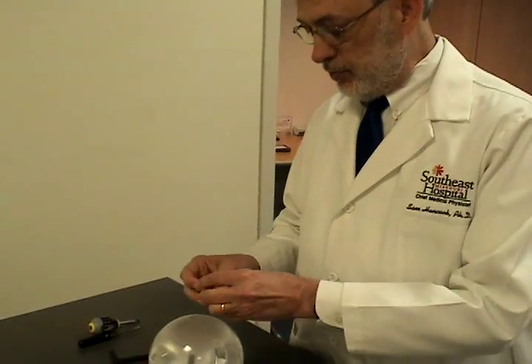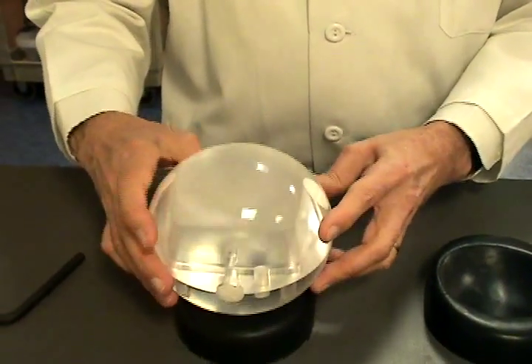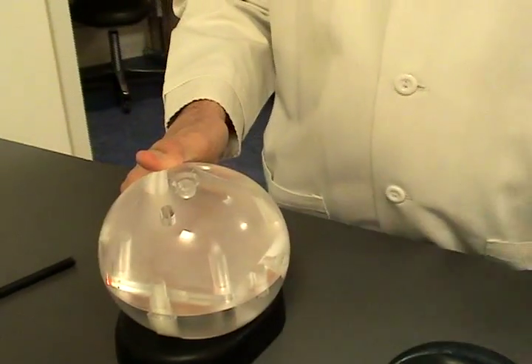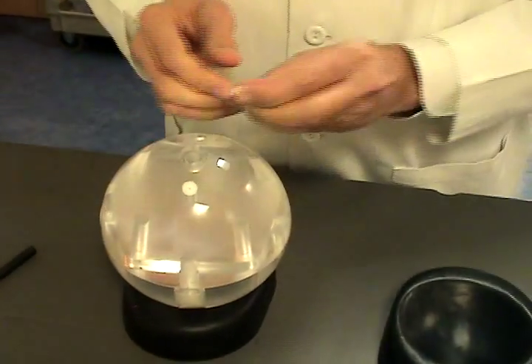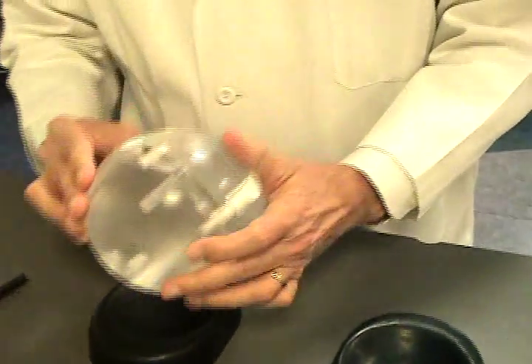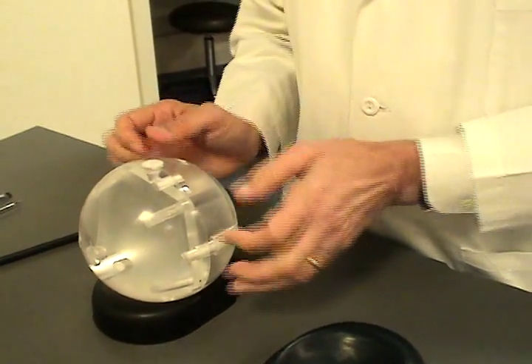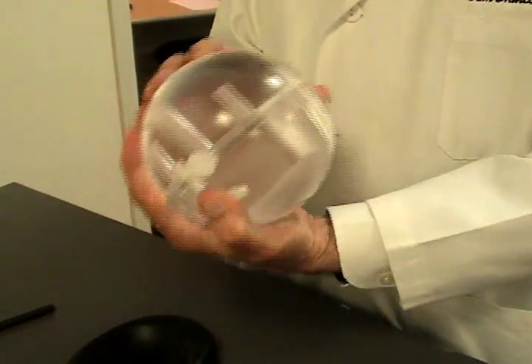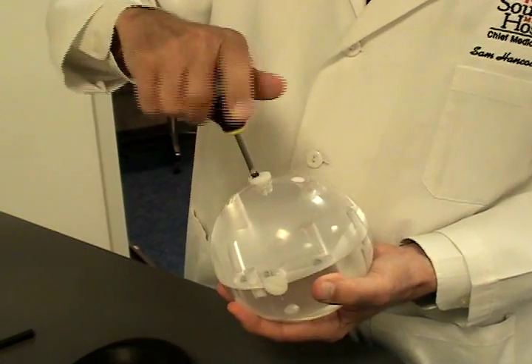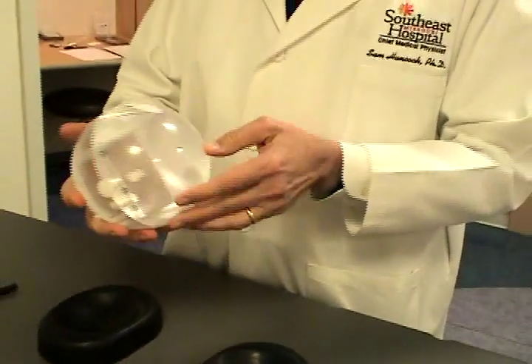Now you want to plug all the holes with the nylon plugs. These are beveled to fit the contour of the phantom. It's almost like putting a puzzle together. The screwdriver that comes with the phantom is used, and now it's ready to be scanned.